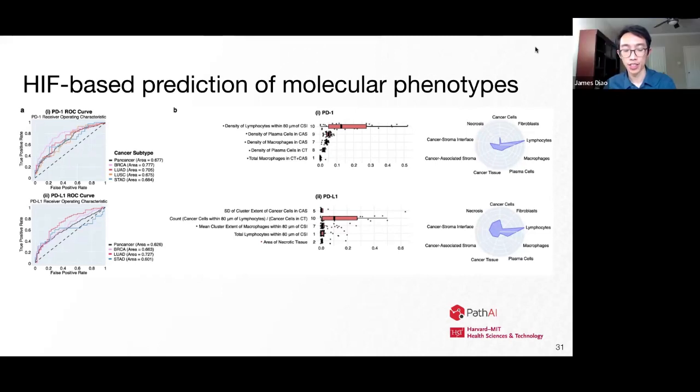I think it supports a lot of previous findings in the literature that lymphocytes in the tumor are very different from lymphocytes in the stroma, and their roles are different. Even breaking it down within B cells, plasma cells and lymphocytes function differently and mediate different processes. In terms of which areas would be most promising for future therapeutic targets, or for understanding what would be most predictive for downstream tasks like prognosis or diagnosis, my money would be on the B cells.